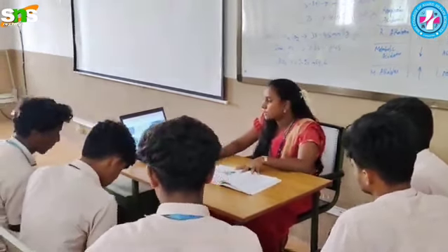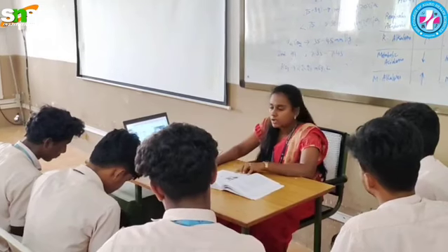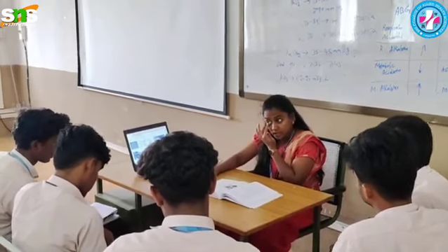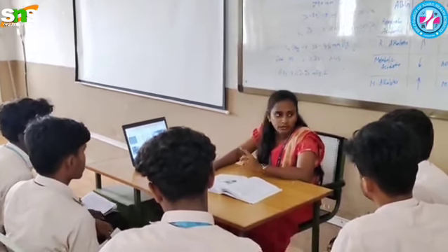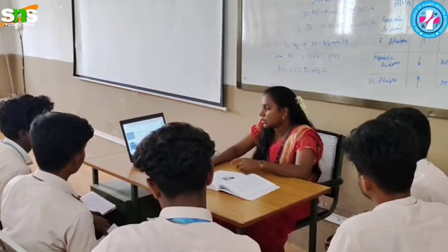Generations of CT scanner. So this is the first generation of CT. There are 7 generations of CT scanner which were developed from the ancient days till now. Okay, so in the first generation CT scanner, the machine looked like this. This is also known as EMI scanner. EMI scanner is nothing but the first CT scanner, invented to evaluate only the brain. Only the head was taken during the first generation of CT scan, and later on the machines got developed.